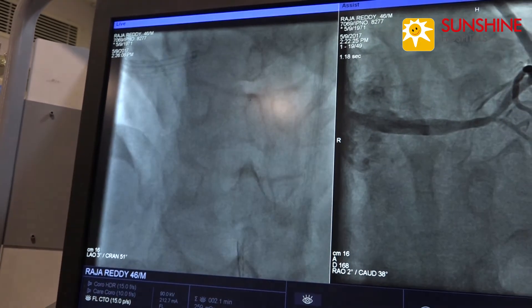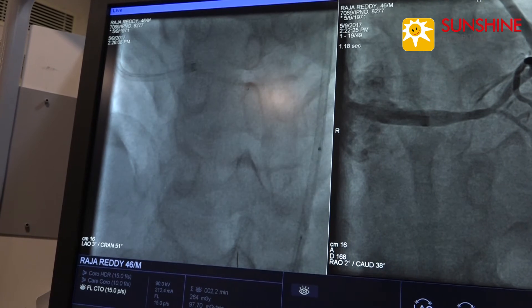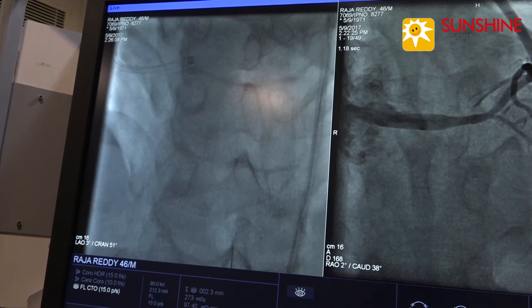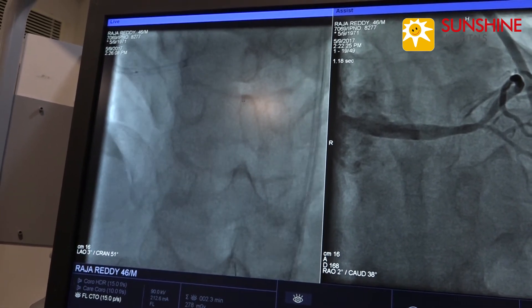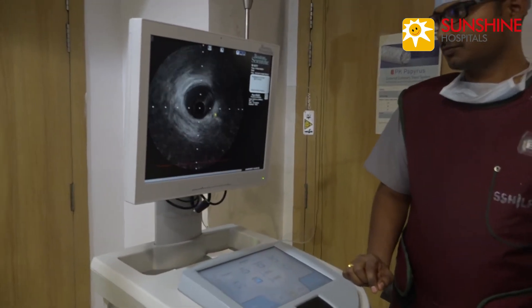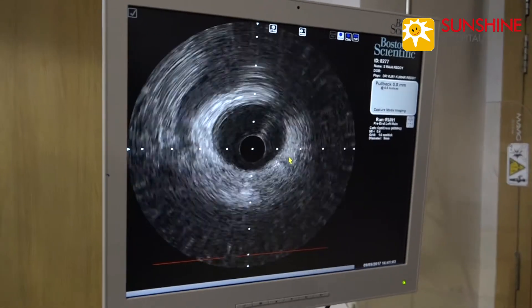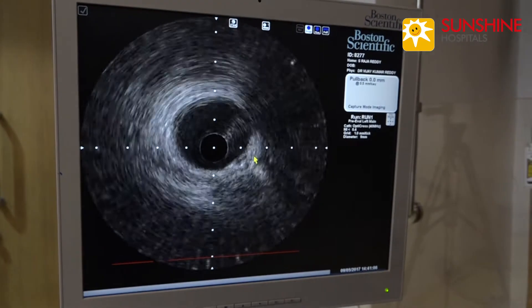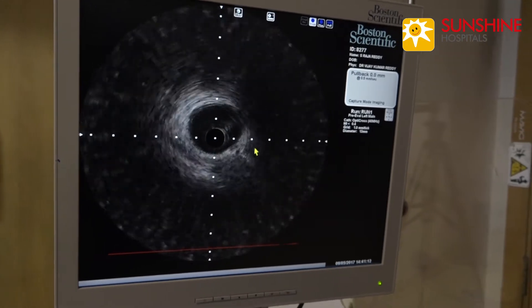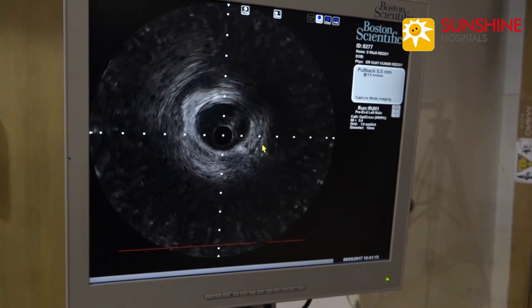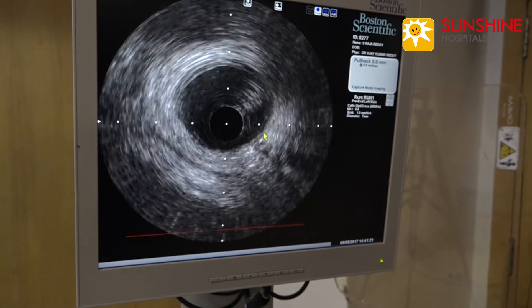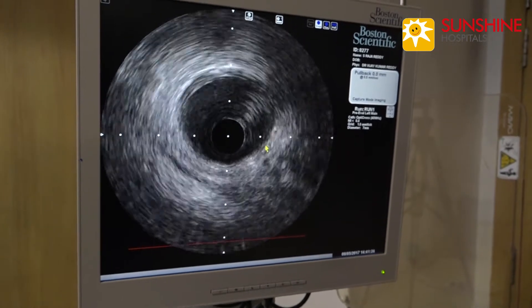Now we are advancing the IVUS catheter, and we are seeing this IVUS catheter in the guide. Now we are showing the IVUS images. On the center, we are seeing the black spot that is the IVUS catheter, and there is the intima, media, internal elastic lamina, and adventitia. All three layers of the vessel are seen in this video.